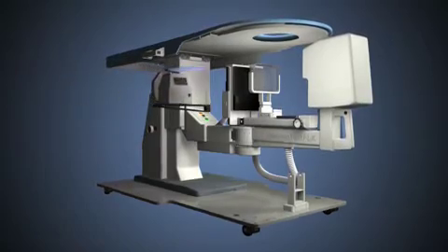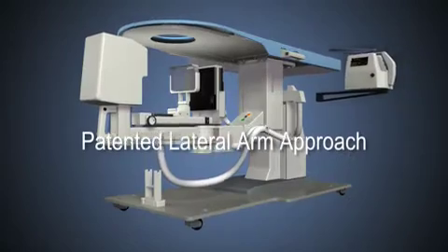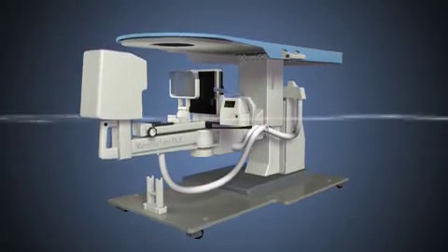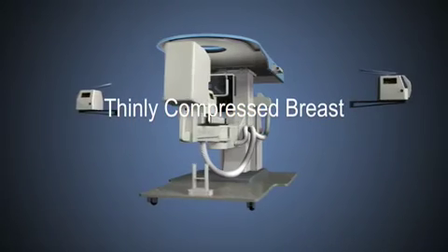Lesion access and target accuracy is further enhanced by the patented lateral arm approach. It's the lateral arm that provides superior access, accuracy, and in many cases the only way to obtain samples from thinly compressed breasts.